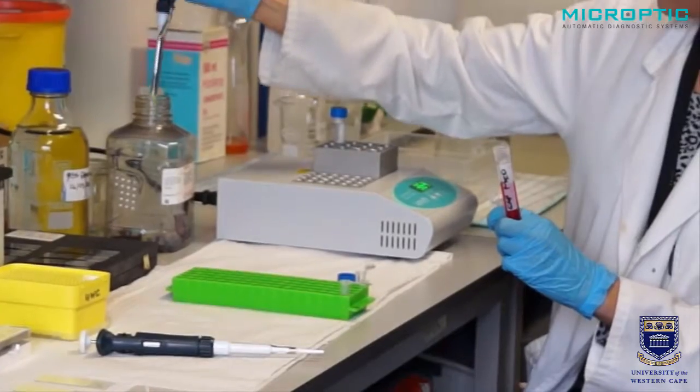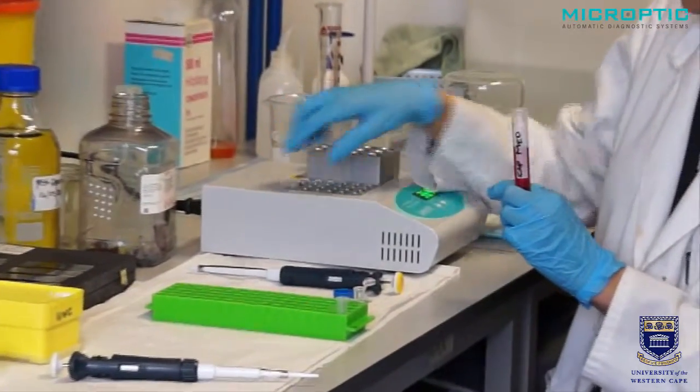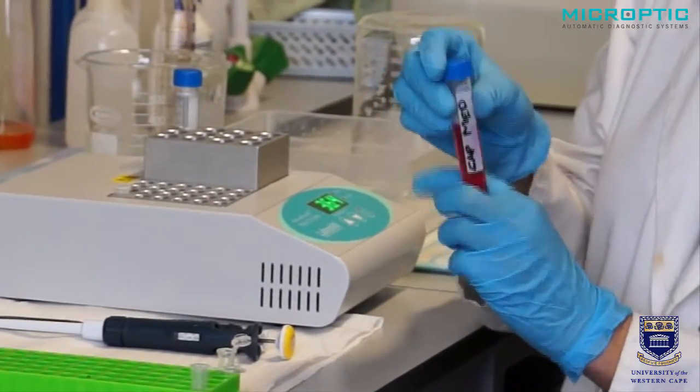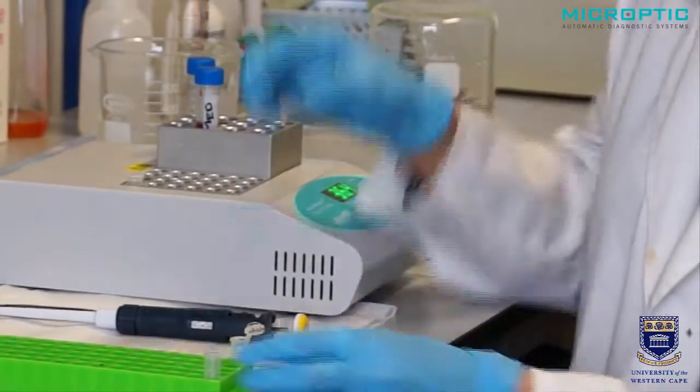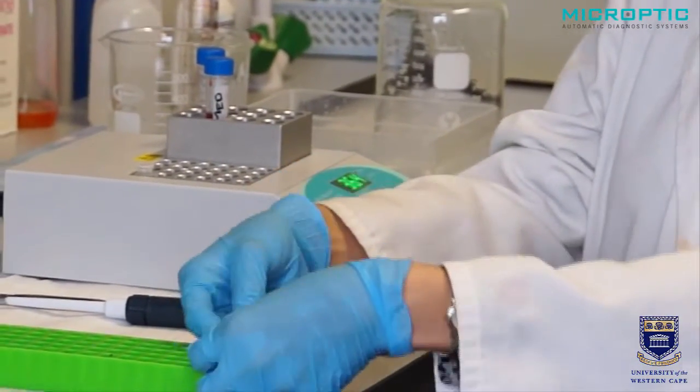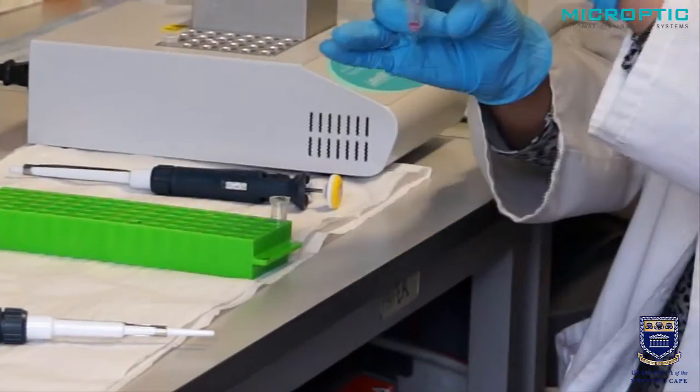We prefer to use HTF capacitation version. That is now added to the Eppendorf tubes after we have thoroughly mixed and diluted the sample about ten times. Please note that this dilution relates to a concentration of approximately 20 million sperm. If the sperm concentration is very high — 40 or 60 million — then dilute more. And if it's less, dilute less.